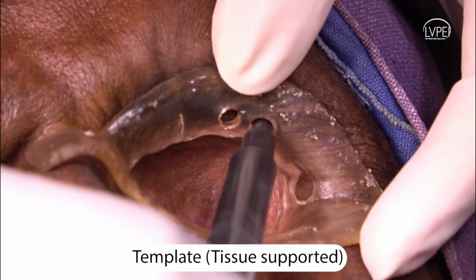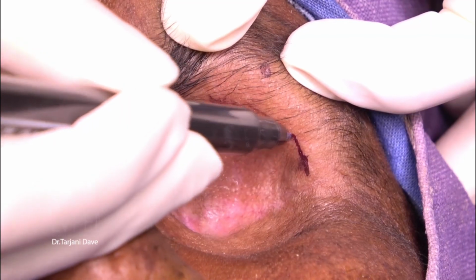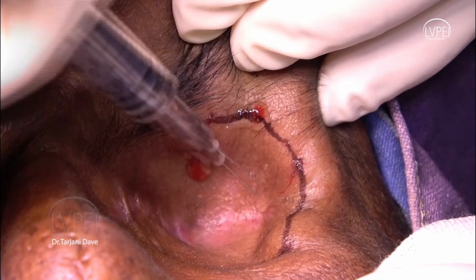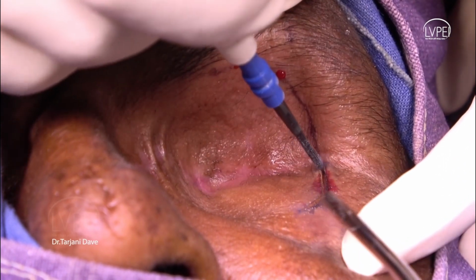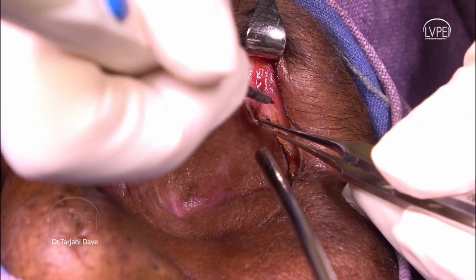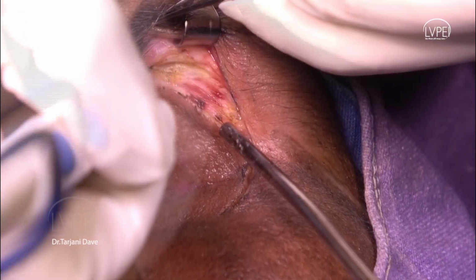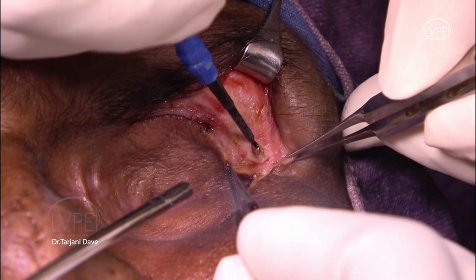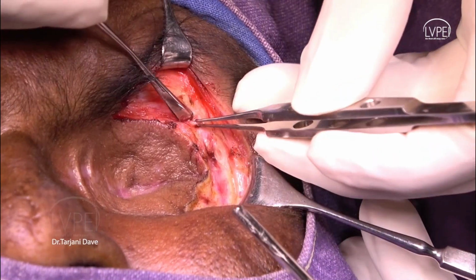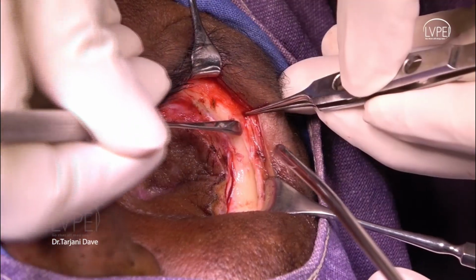Let us move on to the osseointegration step 1. With the help of a soft tissue template, the skin marking is made and joined together. Local anesthetic agent is infiltrated subcutaneously. Skin incision is made with a radiofrequency cautery. Progressively, the subcutaneous tissue, orbicularis oculi, and deeper tissues are incised with a radiofrequency cautery in order to reach the periosteum overlying the lateral orbital wall. Now, the periosteum is lifted away from the bone with the help of the sharp end of a periosteal elevator.